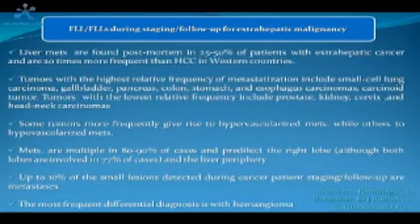The third clinical scenario is the focal liver lesion in the cancer patient. You know that liver mets are really common. The tumors with a high frequency of liver metastasization and a high relative frequency of liver metastasization. Classically, some tumors develop hypervascularized metastasis, others hypovascularized.